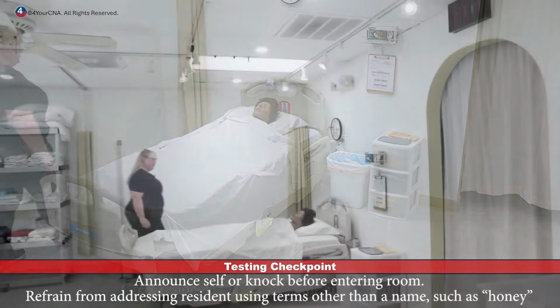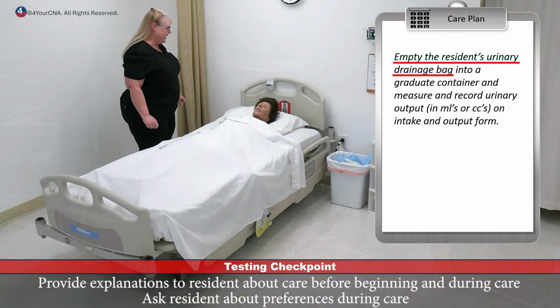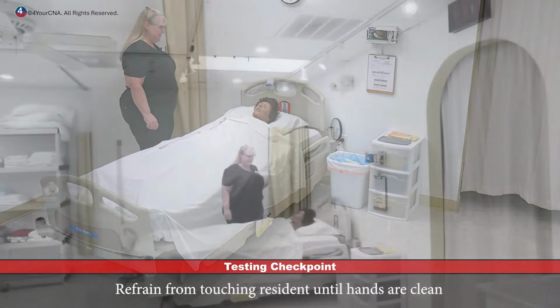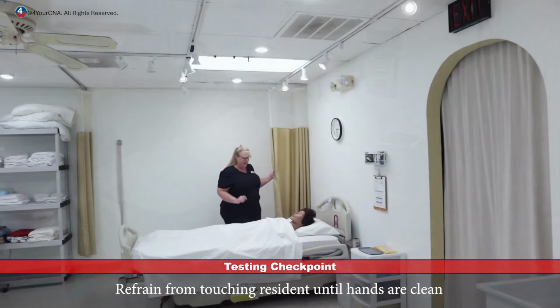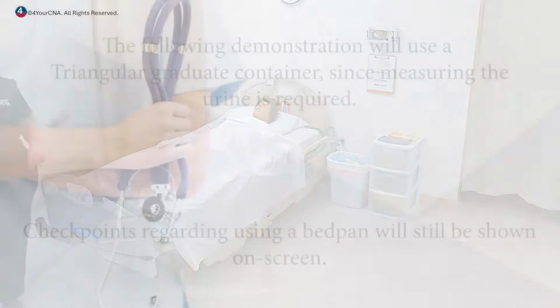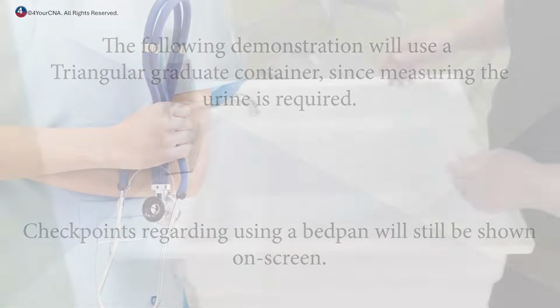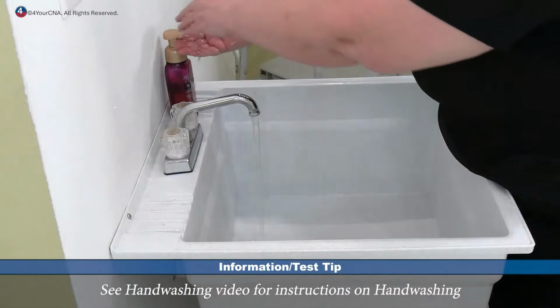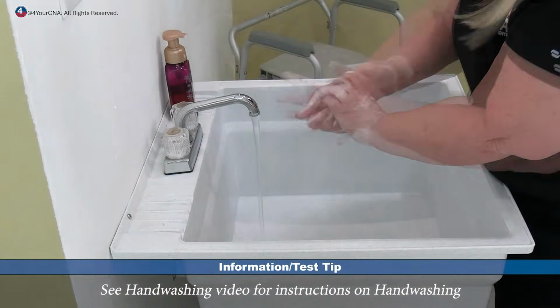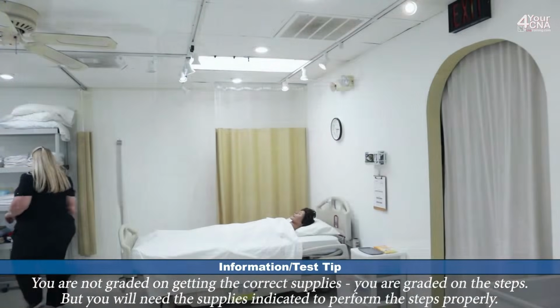Good evening, Mrs. Jones. How are you today? Fantastic. I need to empty your urinary drainage bag. Is that okay? I'm going to close your curtain for privacy, wash my hands, get my supplies, and I'll be right back. After washing my hands, I'll get my supplies.